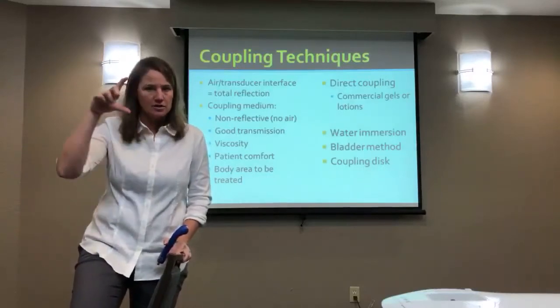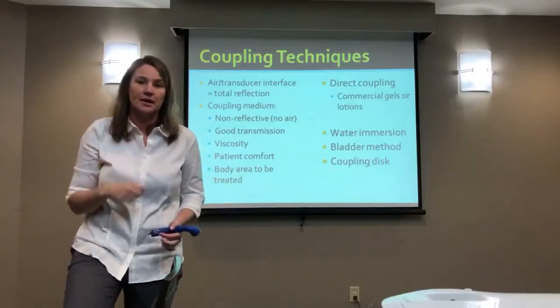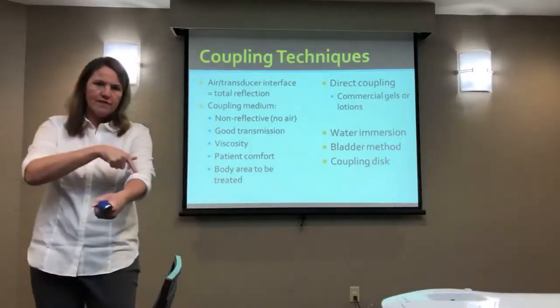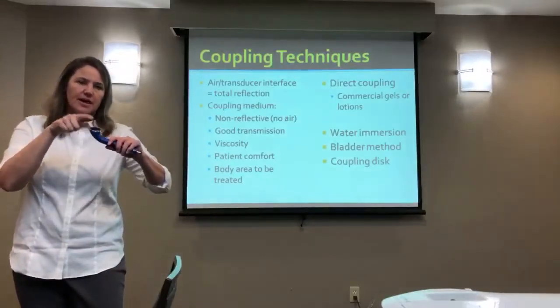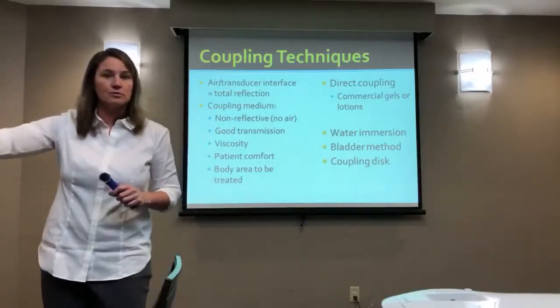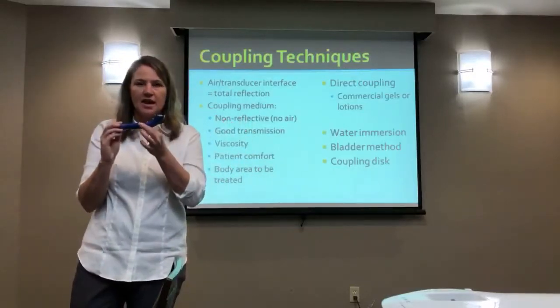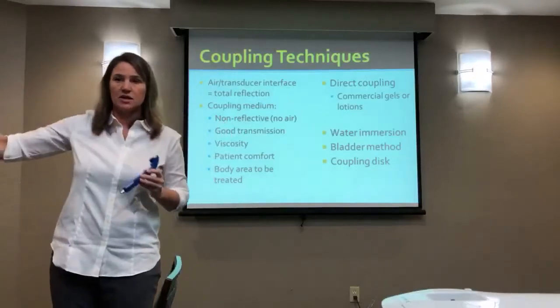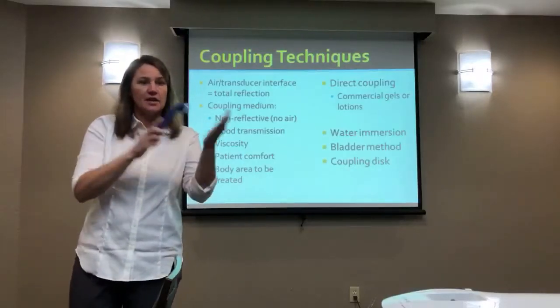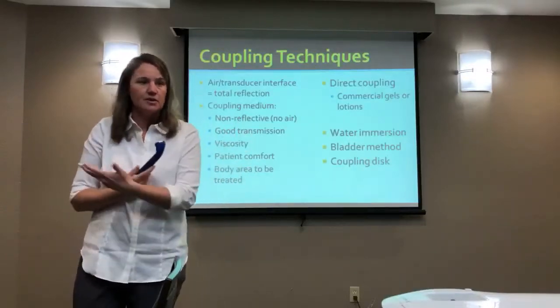If you want to assign them a bottle or a small bottle, or dose it out before you go in so that you don't take a bottle and use it right next to a patient. Another thing along those lines is a lot of people ask me, should I put the gel on the patient or on the sound head? And I would say if you are using a communal gel bottle, a bottle you're going to use on multiple people, then before you ever touch the patient, while you're clean and non-contaminated, and so is the head, put the gel on the head, and then don't touch it again. That way you're not going to contaminate the bottle. So you squirted it on here, and then you did your ultrasound. Now, if you decide you need more gel in the treatment, then you're going to contaminate the bottle.